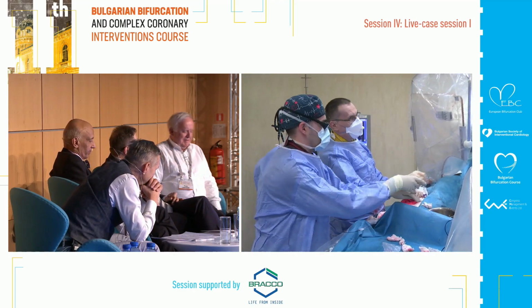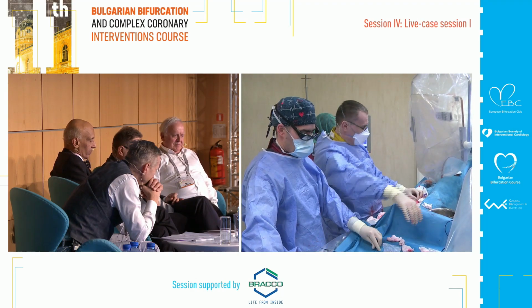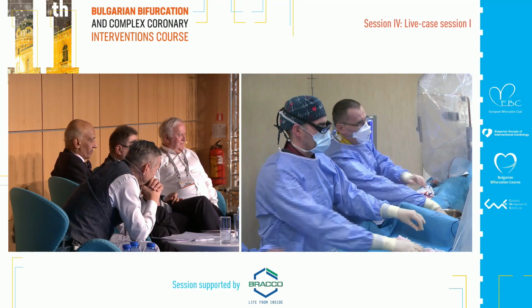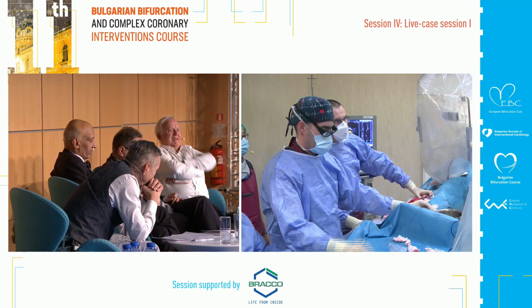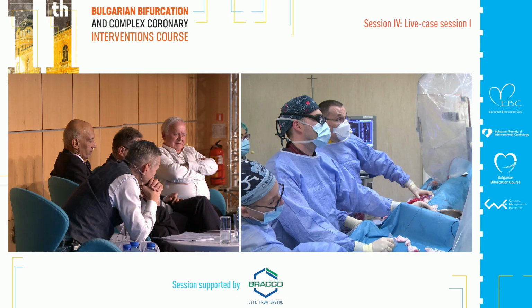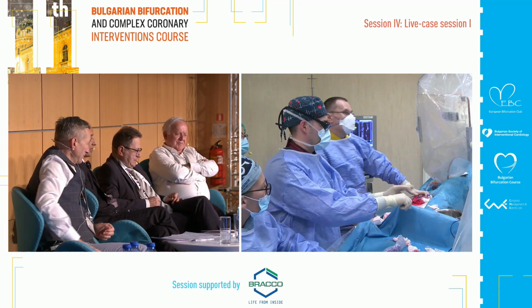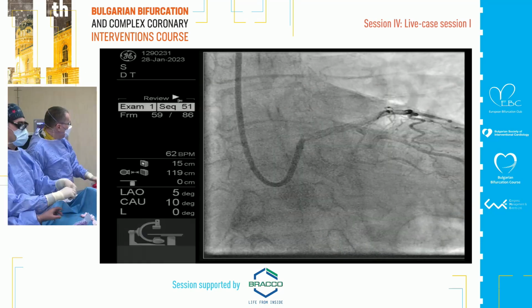Angio, please. Yes, we will do it now. We close the eyes and remove everything. This is the usual strategy before the final shot. Okay. Cine? Yeah, the circ is very open, well, very good. It's good. We will do also the cranial.